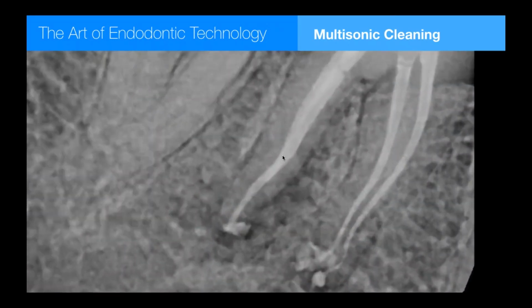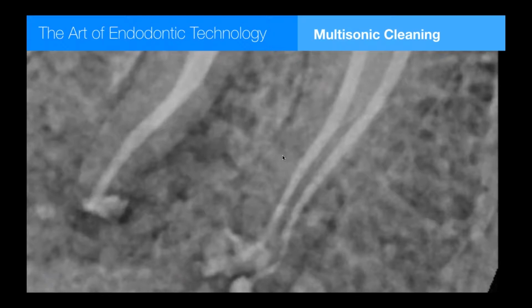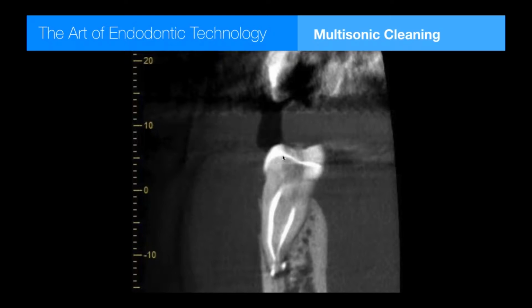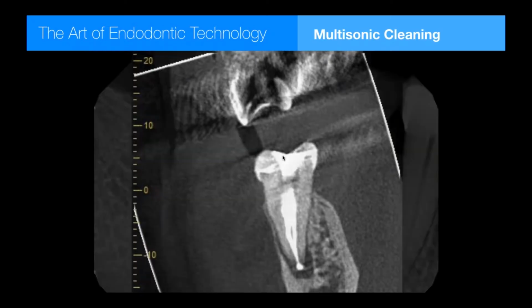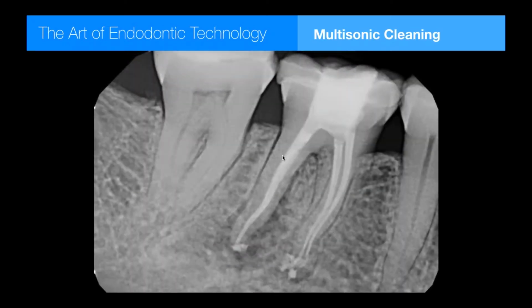So that's a special thrill to be doing it for so long and see anatomic results that I've never seen before. And these look like micro CT imaging results printed off of a 3D print. Here's the post-op. We can see the 2 canals, the distal root merging. I could never fit a cone because there's like 5 or 6 different curvatures in the apical 2 millimeters in the mesial canal. So not only can we clean these spaces that we can hardly get a file through, we can obturate these spaces. As long as they got cleaned out, we can fill anything. So multi-sonic cleaning is really making obturation a lot more fun of a sport.